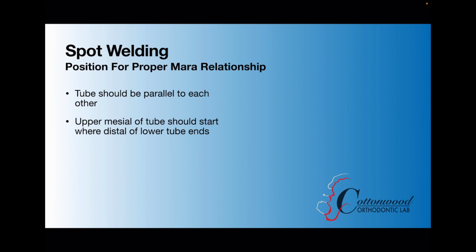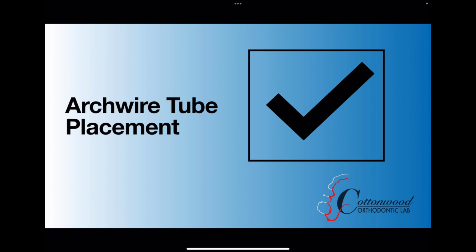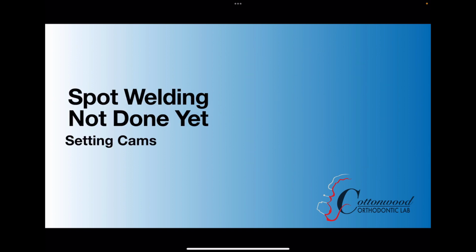Next, we're going to be looking at spot welding for the large tubes. But we want to assure that the archwire tubes are set correctly. So we're going to go over those really quick. You want to make sure that the mesial of that upper archwire tube is where the distal of that lower archwire tube starts. And that's indicated by the green line. Once again, confirm that your archwire tubes are parallel to each other. That's our main focus. Okay, archwire tube placement is done. Let's move on to setting the cams.